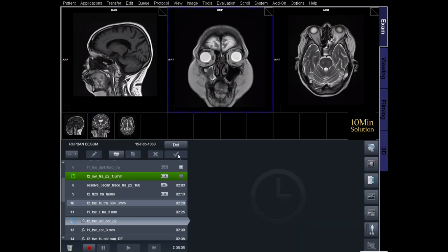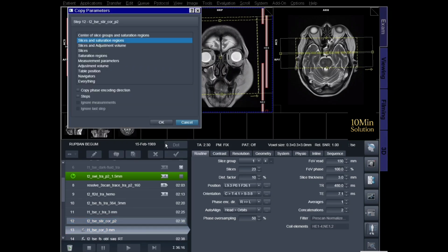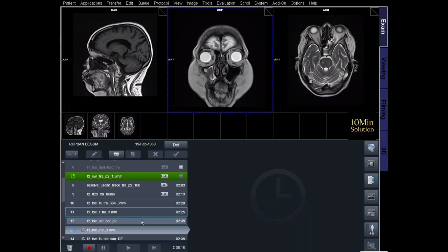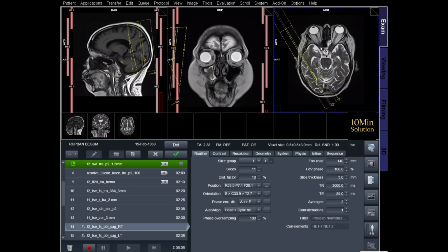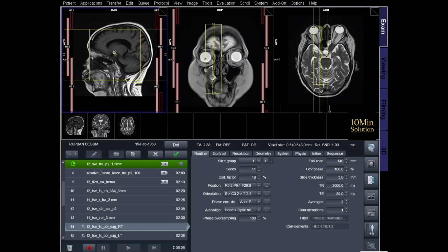Patient positioning. The patient is positioned in the supine position on the MRI table. The head is placed inside the head coil, and head immobilization pads are used to minimize movement during the examination. The patient should be instructed to keep the eyes gently closed and avoid eye movement during the scan. This helps reduce motion artifacts and improves image clarity.